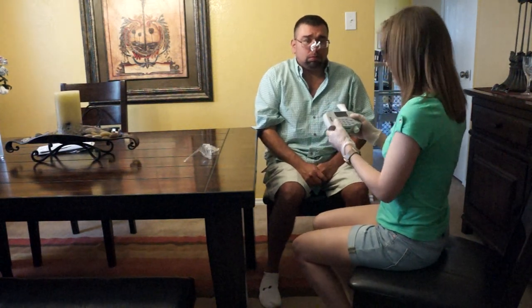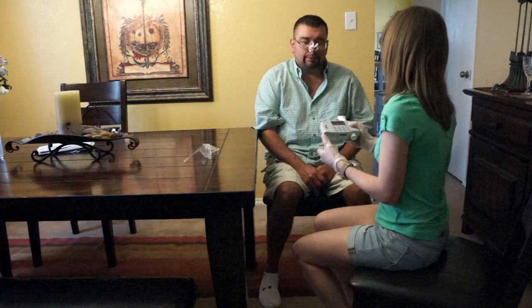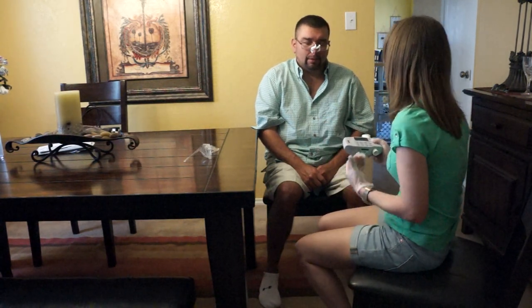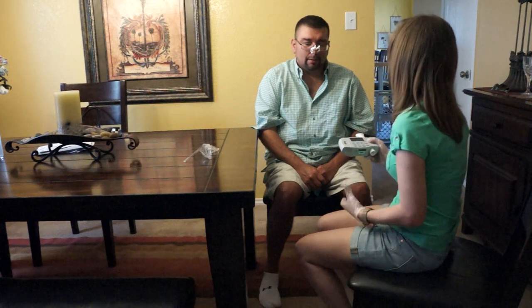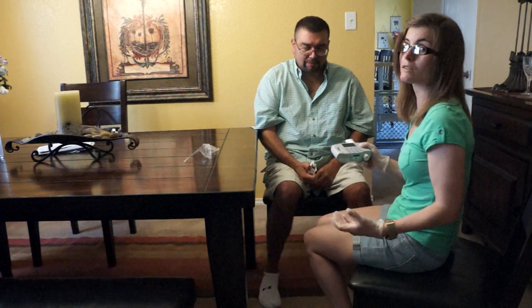Okay, so this one's saying blast out faster. So it didn't get a good effort that time. So I'm going to give you a couple minutes to collect yourself, catch your breath. And this is the part where you want to make sure that they have enough time to give a good test.